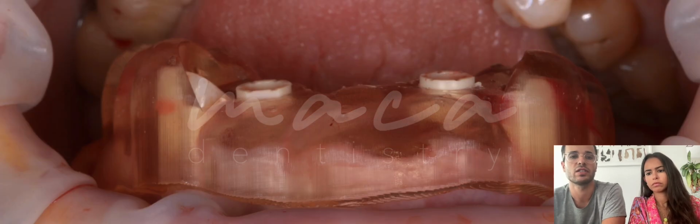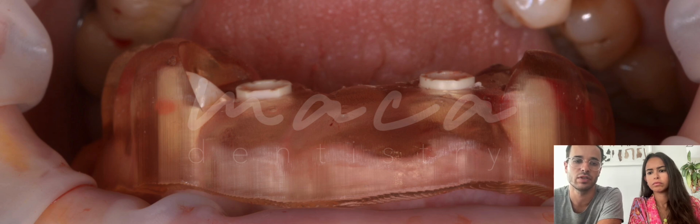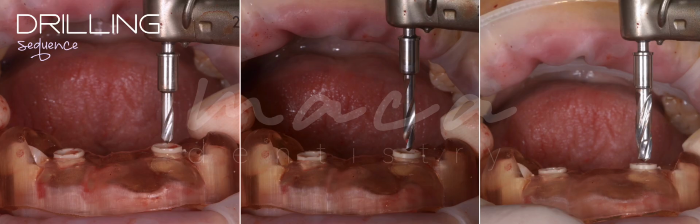So after the extraction, we place the guide, and first we have to check the fitting and the stability of the guide. To do that, normally what I do is look at the cusp of the teeth, and I have to be sure that the guide is properly seated there. So if the guide is in the correct position, we can proceed with the drilling, and what I like to do is to drill one implant at a time and then place it. This is the way that I can make sure that I achieve enough primary stability in order to be able to do immediate loading.